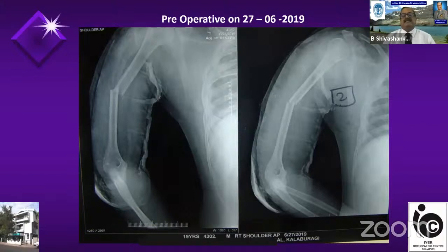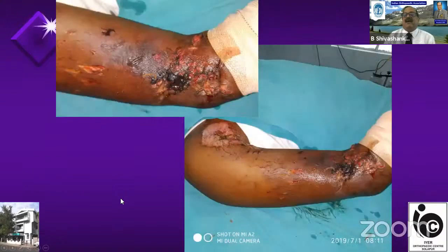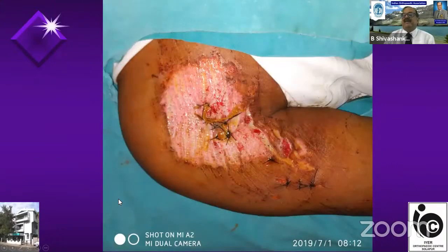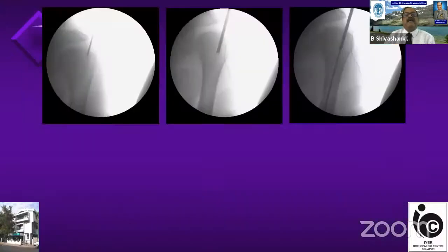This is an interesting case. A fracture shaft humerus came to me almost 7 or 8 days down the line. He had consulted many people in different cities before coming to me. This was the wound which precluded the earlier surgeons from doing the plating which was advised to him. See the bad skin at the elbow, see at the shoulder. So this is on table. The very next day I took the patient for surgery. This is the shoulder. I wrapped it up totally with a sterile drape.